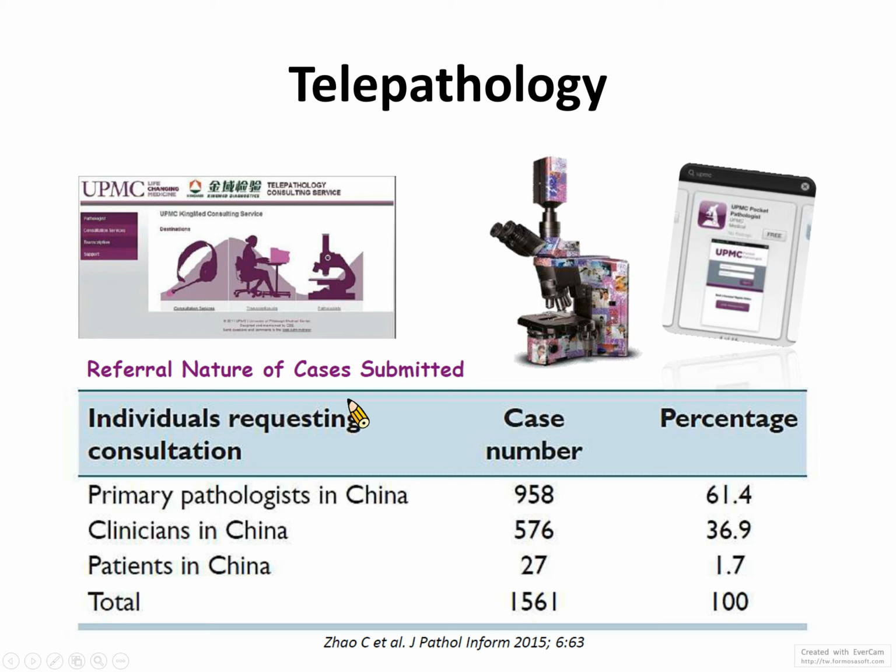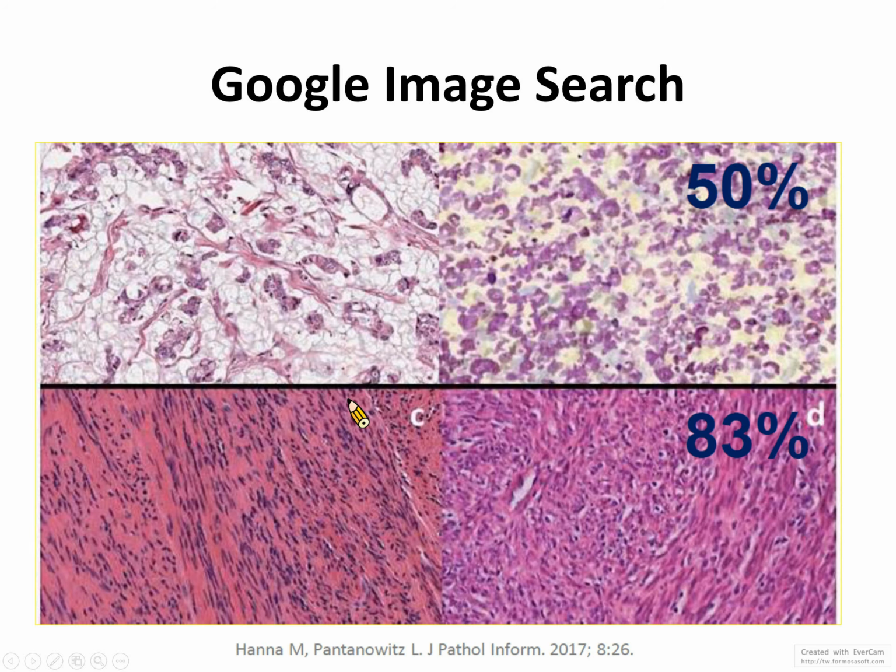That is one of the advantages of digital pathology that changes the practice of pathology, because in the older times, if you wanted to consult the pathology image with another pathologist, you needed to mail the slides to the other place, and that took lots of risk, because the slides may be lost or broken. So telepathology is one of the advantages of digital pathology.